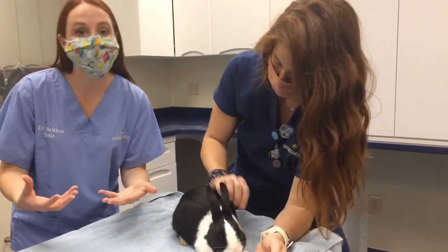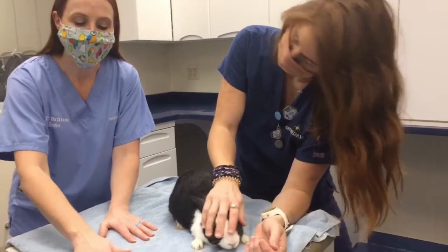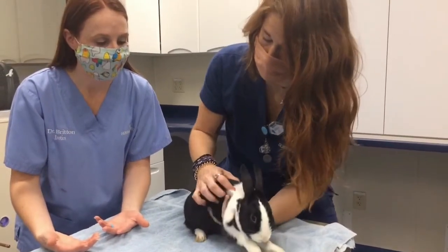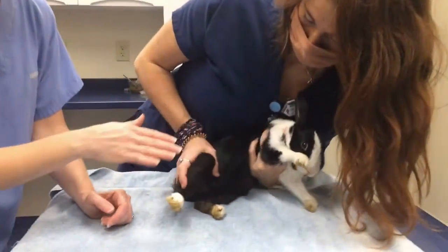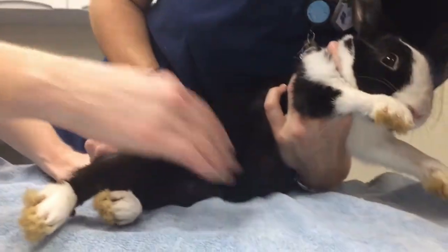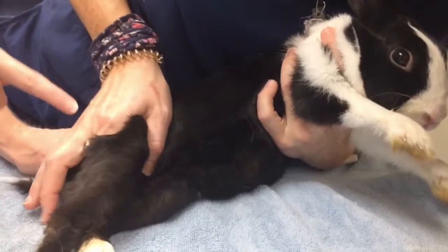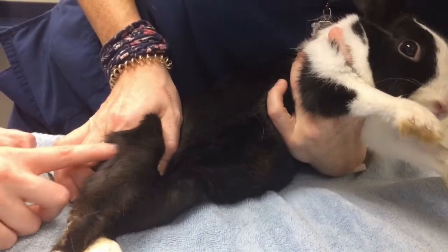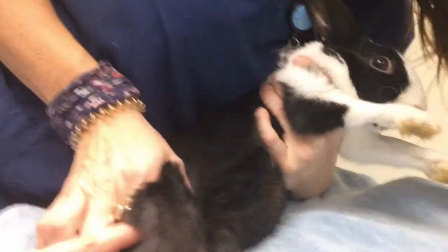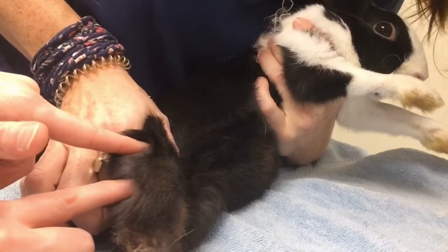Another way to draw blood — the in-the-air method — is a little bit difficult. You can try something on a stable surface like a table. Always use a towel in between the table so that there's no slipping. You do this very similarly to how you would do a cat. Take that same hold along the chest, then put them along the lateral side of the table. The support is coming from the table, and Kate is still able to hold off above the knee and feel for the vessel before putting any alcohol on it. The vessel sits right here — it is more caudal than you expect, and usually a little bit closer to the knee where it's crossing over and easiest to see.